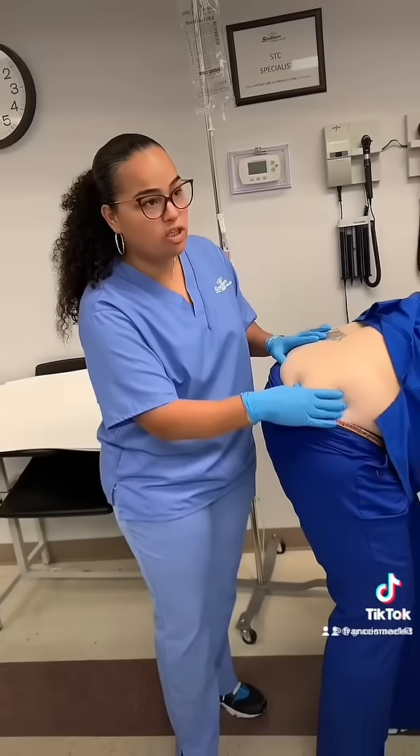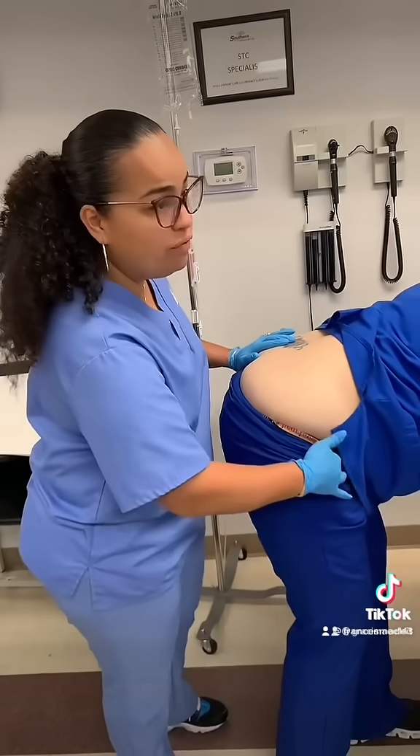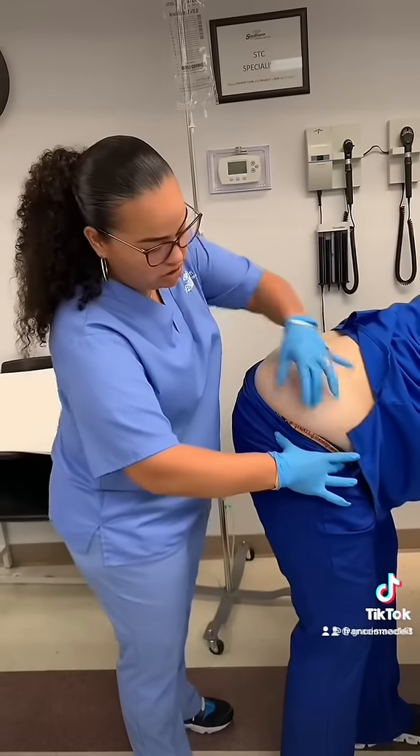The more relaxed they are, the better the muscle is. This is one way you can do it. The other way is to feel for their hip bone and go across. Once you go across, you know that this is your area where you can inject.